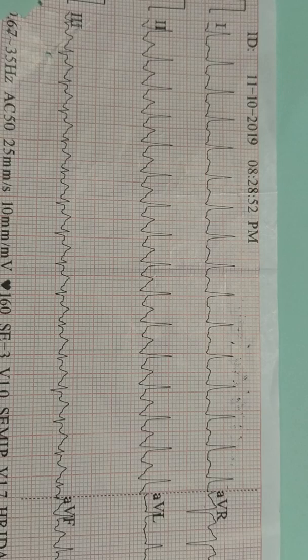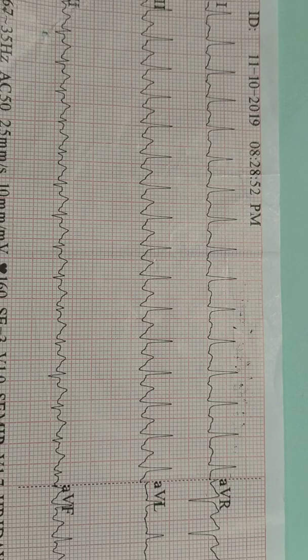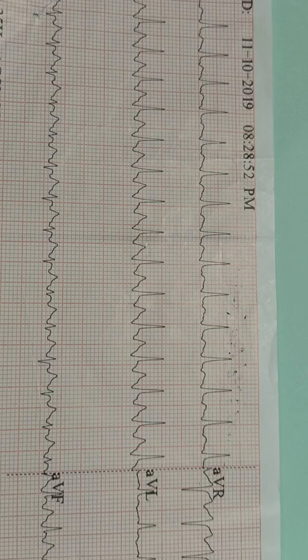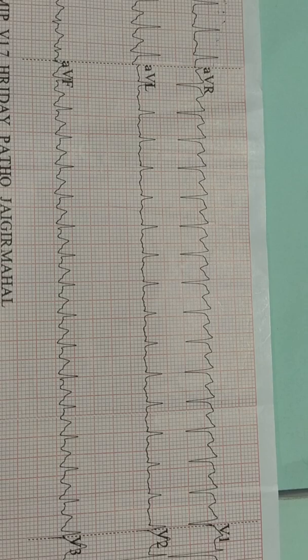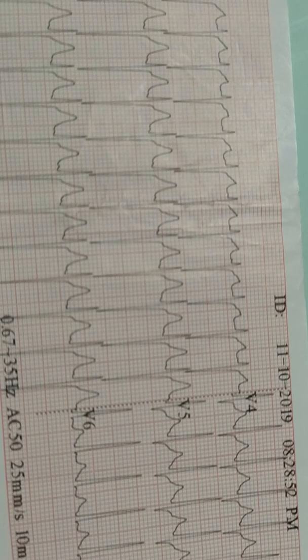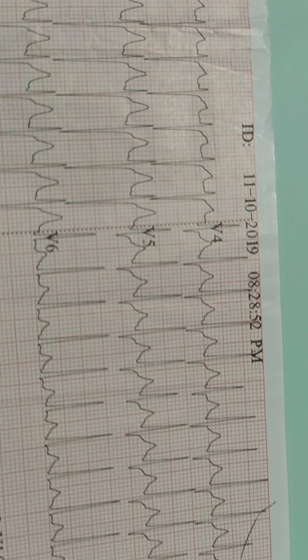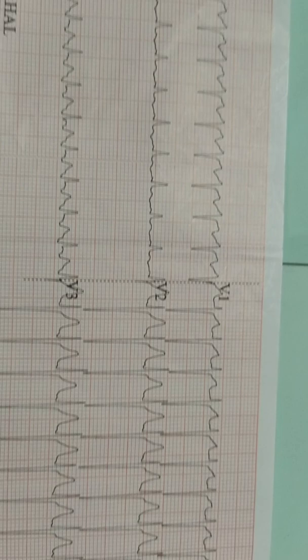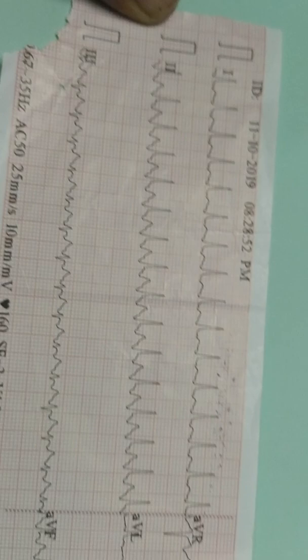When you find any ECG where P wave is absent, tachycardia, regular rhythm, but the QRS complex is narrow, then confidently you will diagnose the ECG as supraventricular tachycardia. And if the only difference is that the QRS complex shows wide, then the diagnosis will be ventricular tachycardia.